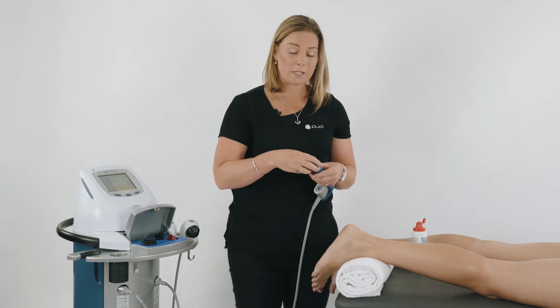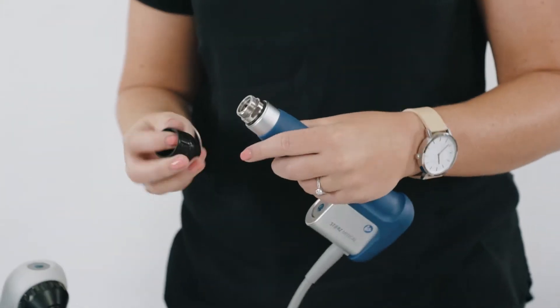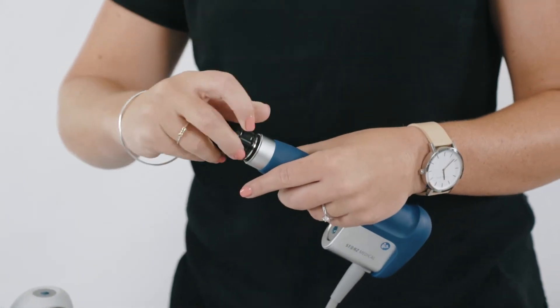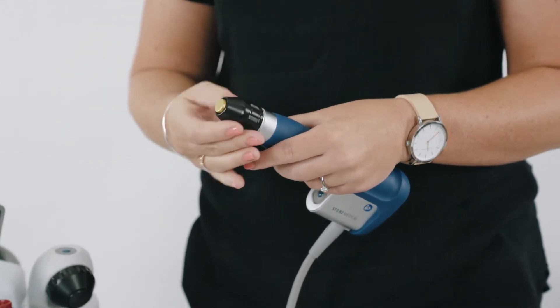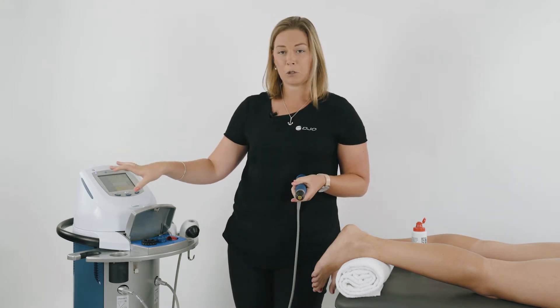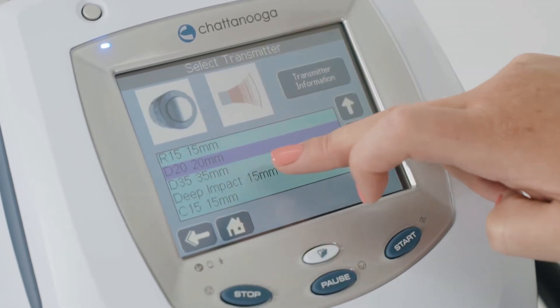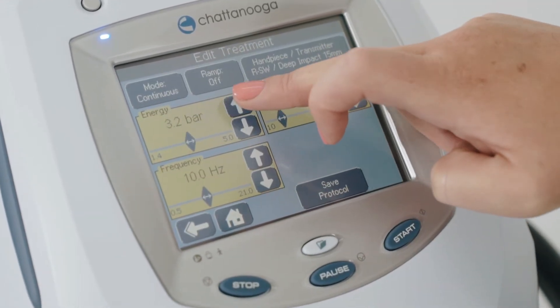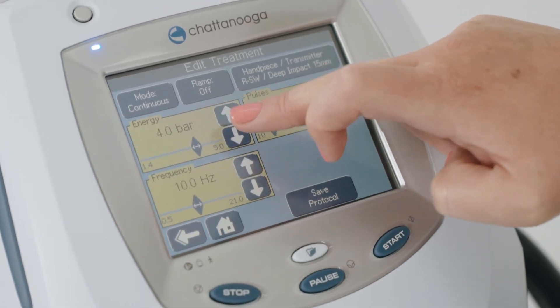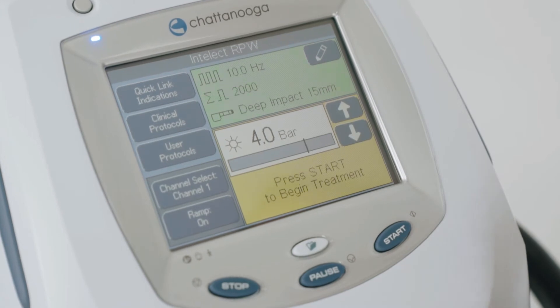Once we've finished treating the trigger points in the calf, we're going to change the transmitter and put on the Deep Impact 15. This is the preferred transmitter for the plantar fascia. Go to the screen and change the settings — you can choose your clinical protocol or adjust. Select the new transmitter, the Deep Impact 15, and put the energy up to 4 bar, selecting the ramp feature.